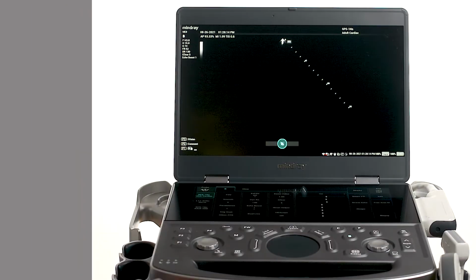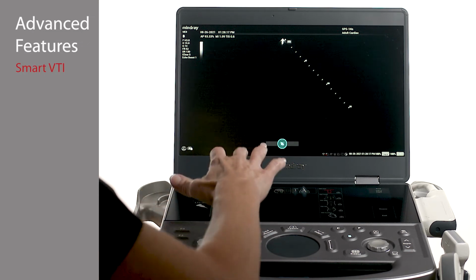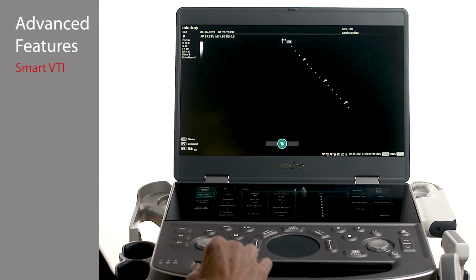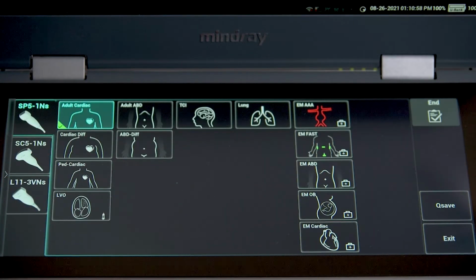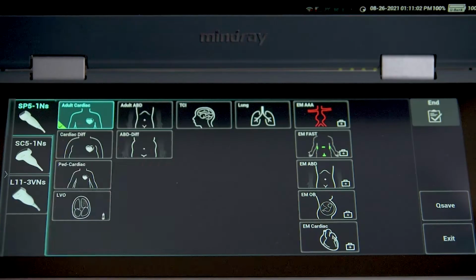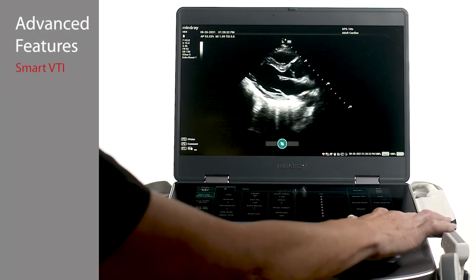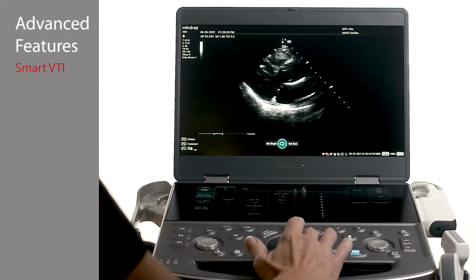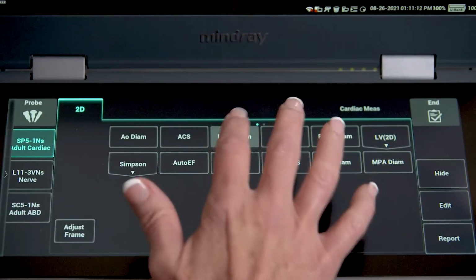The Smart VTI tool provides quick analysis of a patient's stroke volume and cardiac output. Smart VTI is done while live scanning and cannot be applied to a previously saved clip. Begin with your phased array transducer in a cardiac or fast exam mode, then measure the LVOT diameter. The LVOT value may be entered later if desired.